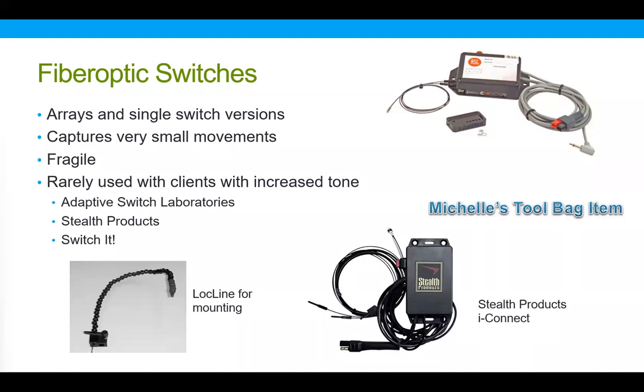And so it seems instantaneous to you and I, but these capture very small movements. The cables have to be well protected when they are mounted. This is not something we just hand off to someone. It has to be mounted somehow. Earlier, we saw a client that I work with where we had popped that fiber optic terminus, the end of that, through a hand pad of an arm trough, and the cables were carefully protected underneath.